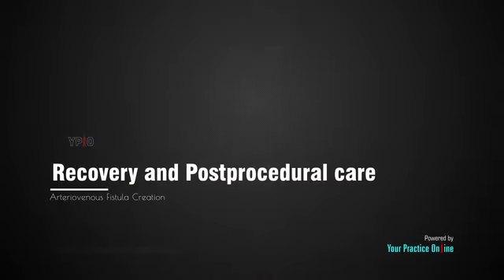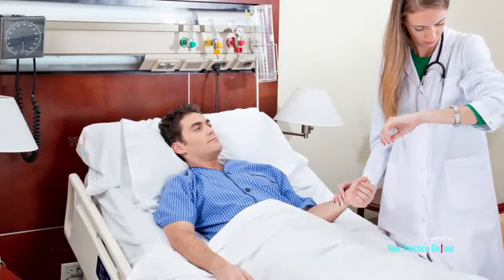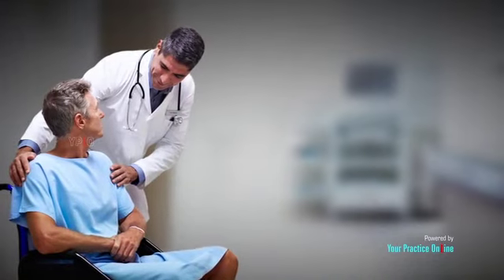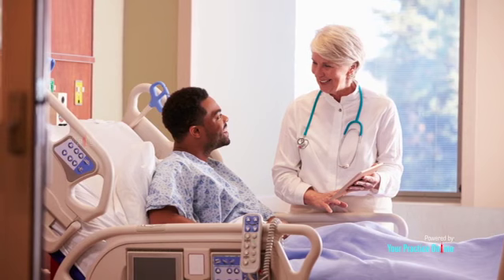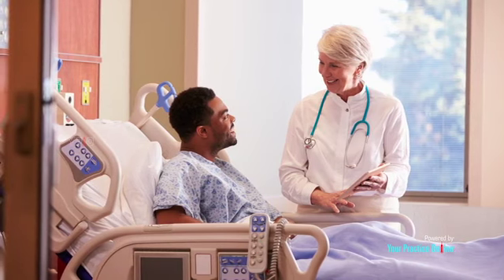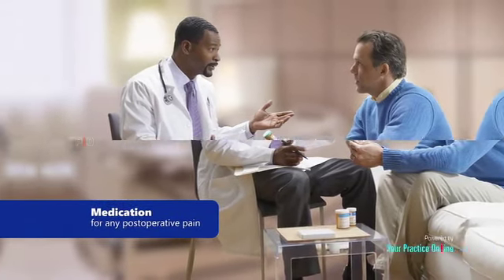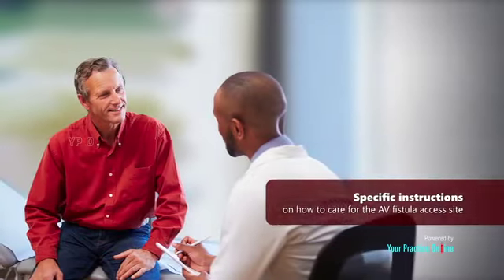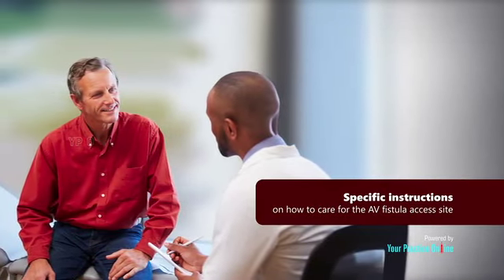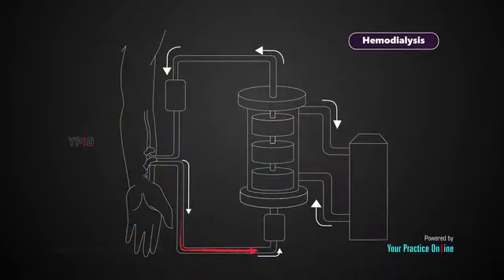Recovery and post-procedure care. AV fistula creation can be performed in an outpatient setting, and most patients can expect to be discharged after a few hours in the recovery room. There may be a slight discharge for 24 hours and soreness from the incision site for a few days after surgery. You will be given medication for any post-operative pain and advised to keep the arm elevated to reduce swelling. Specific instructions will be given on how to care for the AV fistula access site. It takes about 2 to 3 months before the fistula is developed and mature enough to be used for hemodialysis.